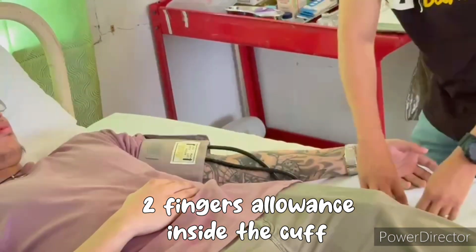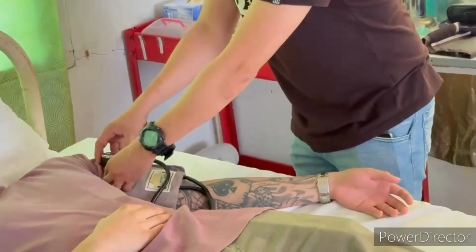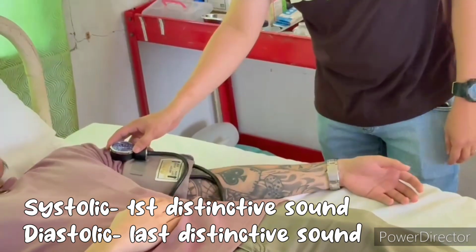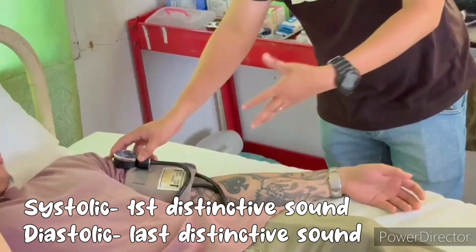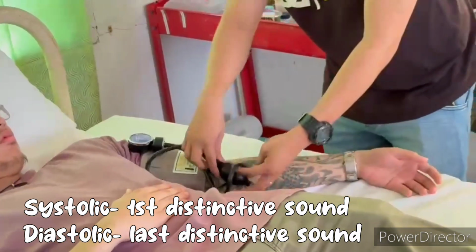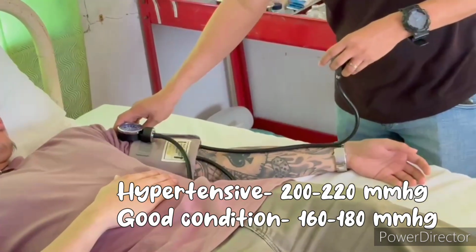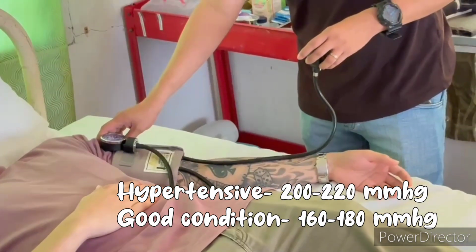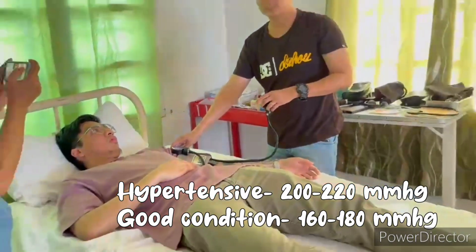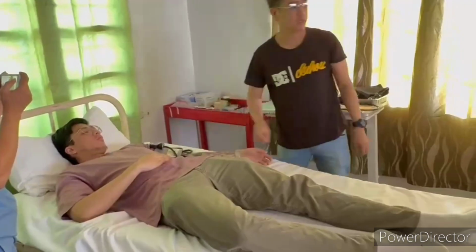Okay? And then after doing that, we also have to put the gauge on the cuff for us to be able to see the systolic and diastolic pressure. So systolic is the first distinctive sound that you're gonna hear. And then the diastolic is the last distinctive sound that you're going to hear from the stethoscope. Okay? So, if the patient is hypertensive, we can inflate the cuff for about 200 to 220 millimeter mercury. But if the patient is in a good condition, we just have to inflate the cuff for about 160 to 180 millimeter mercury. Okay? So, after placing the cuff, we can now get the stethoscope.